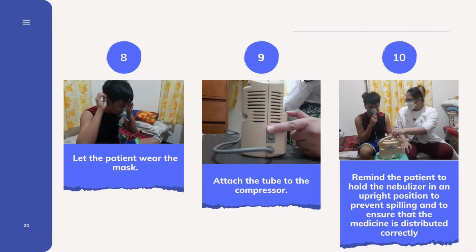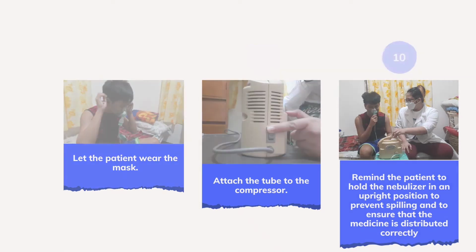And lastly, remind the patient to hold the nebulizer in an upright position to prevent spilling and to ensure that the medicine is distributed correctly. Moreover, tell the patient to take regular breaths through the mouth so that the medicine will be absorbed deeply into the lungs.